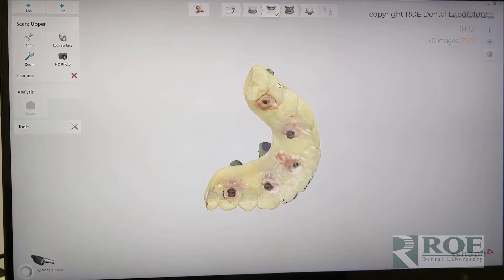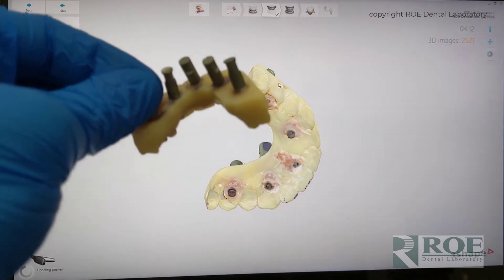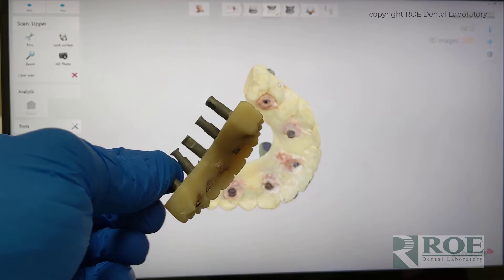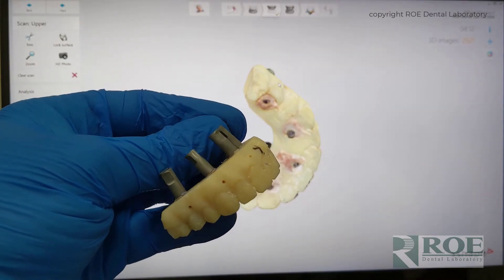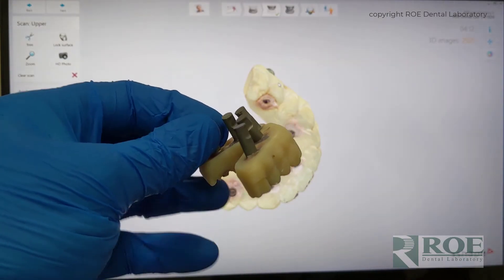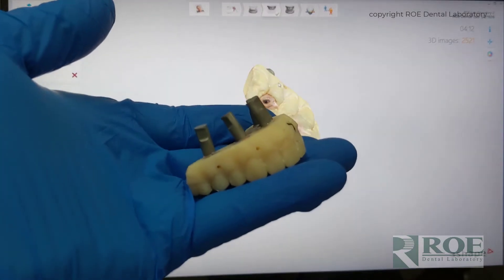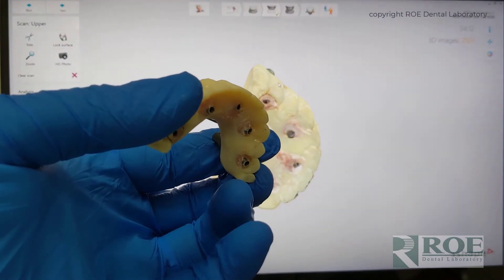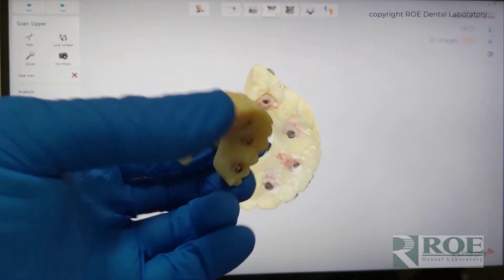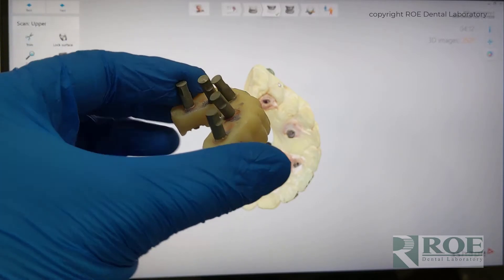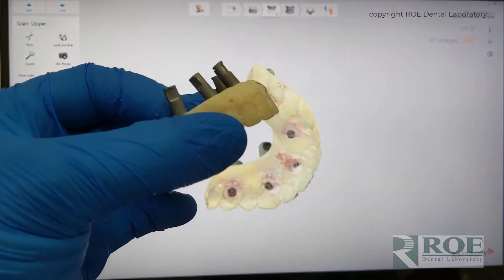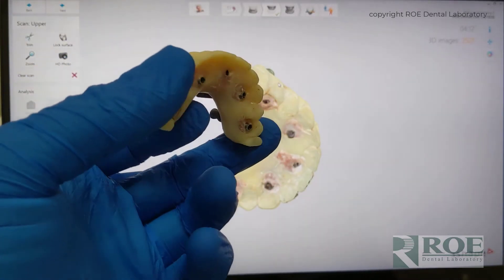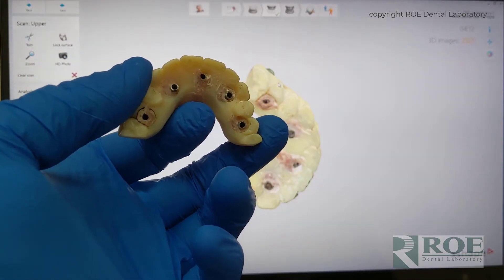The iJIG scan side is finished. Now the next step is to remove these scan analogs and screw the prosthetic back in the mouth. Then we'll scan the bite and the opposing, and you can see that really completes all the records that you need to make another prosthetic.